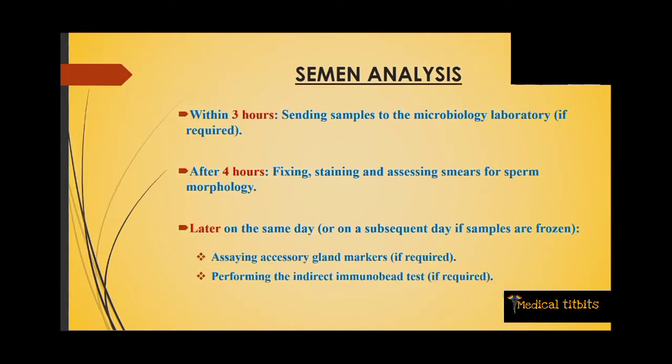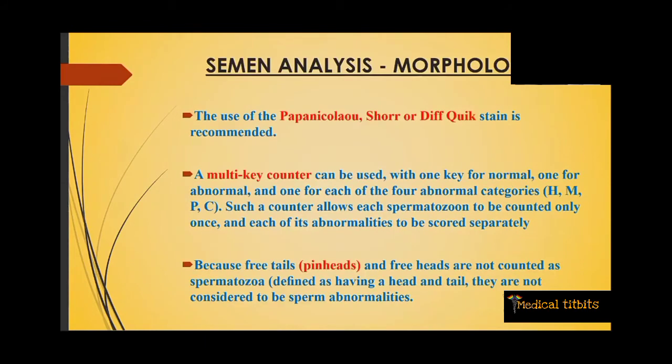Now what to do in the next 3 hours? You have to send samples to the microbiology lab if it is needed, and then fixing and staining the smears for morphology has to be done. And later in the same day, subsequent tests have to be done. This is from the WHO manual.